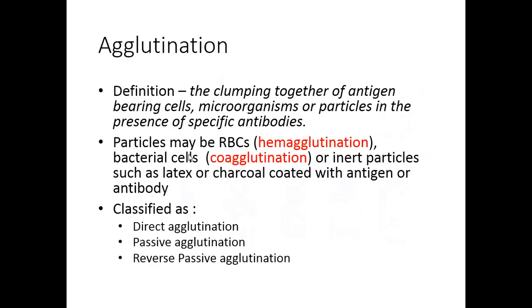Yes? All right. And we're moving on to agglutination, and we're almost done. Agglutination is a little bit easier, I think, to imagine than precipitation. The techniques are very, very much the same. And this is a much more visible reaction, so I think it's a lot easier to see.